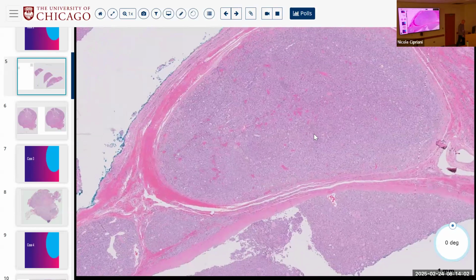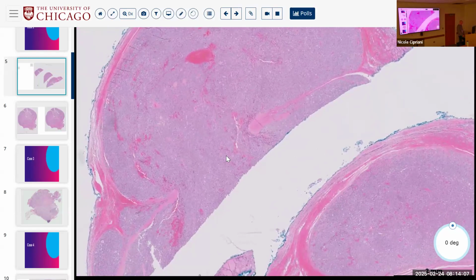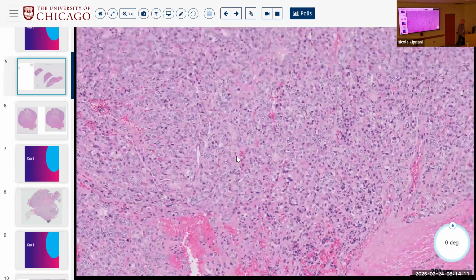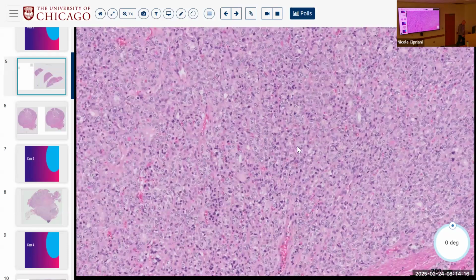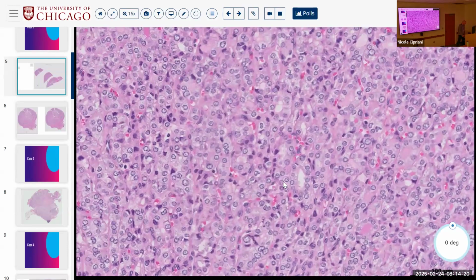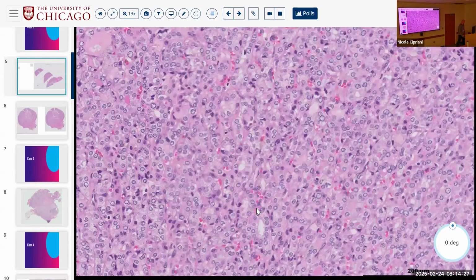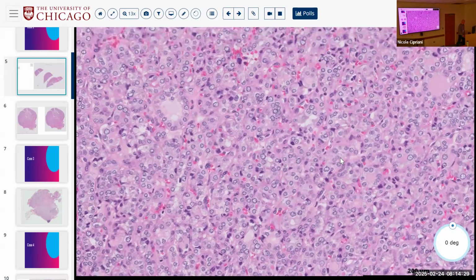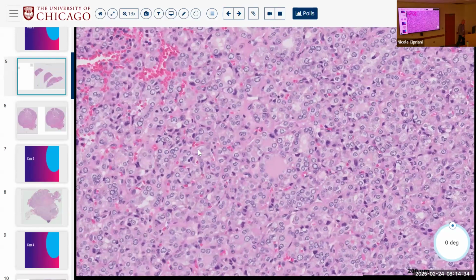Okay, so with the capsule, maybe with some breaking through the capsule, with some follicular and nested architecture, how are the nuclei looking? Are they really worrisome to you, or are they not so worrisome? I would say not super worrisome. I mean, there's some clearing here and there. Yes, there will generally be clearing, but a lot of them are round, right? A lot of them don't have significant elongation or grooving, but many of them do have some clearing. So, you know, it is what it is.